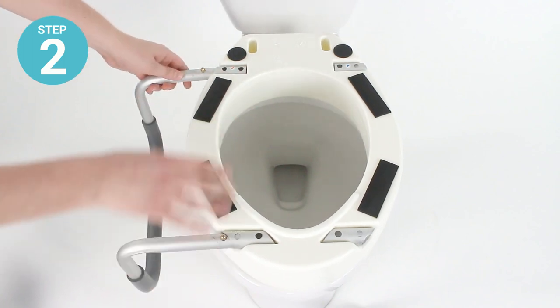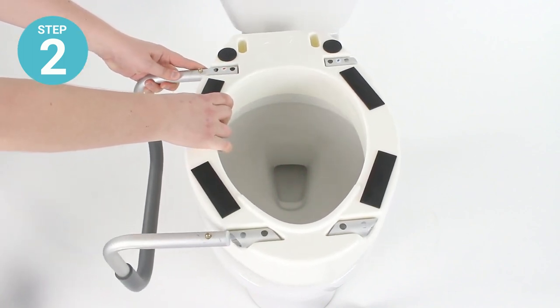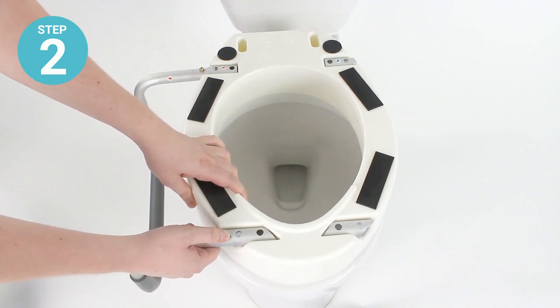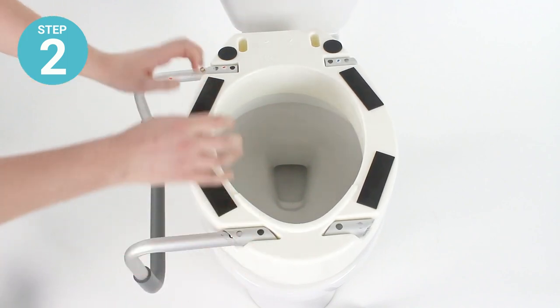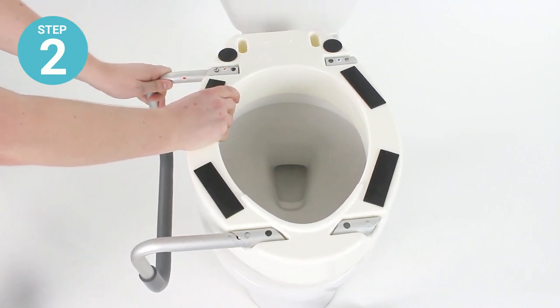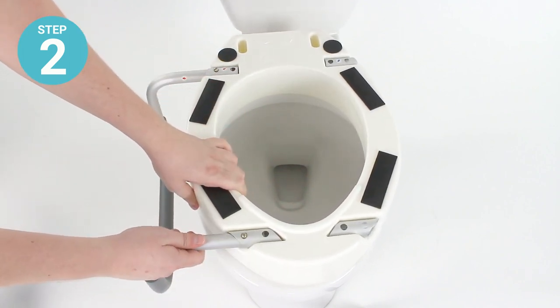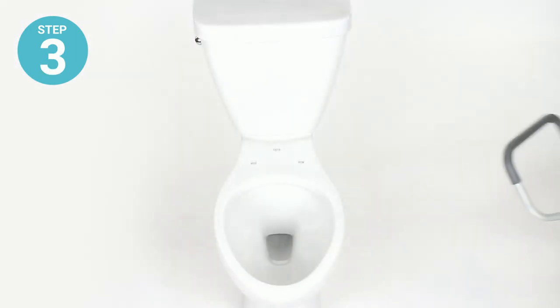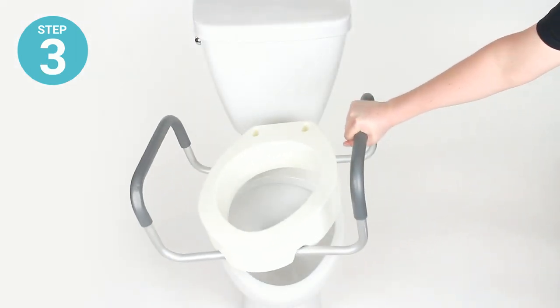To fit the armrests in, make sure that the longer unpadded end of the armrest is oriented toward the front of the riser. Fit the ends of the armrests into the sockets, depress the locking pins, and push them into the sockets until the locking pins click into place. Repeat these same steps to install the other armrest on the opposite side.